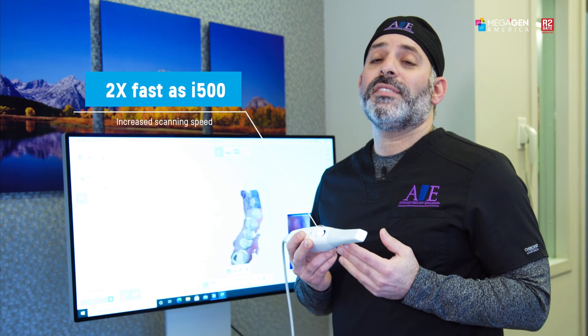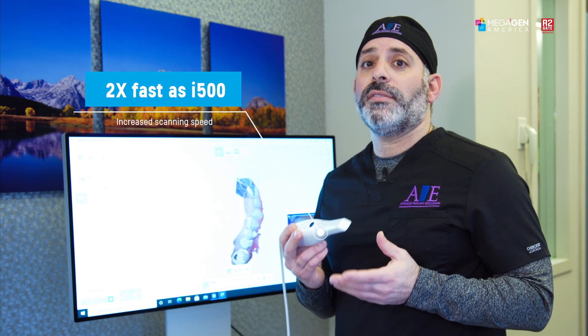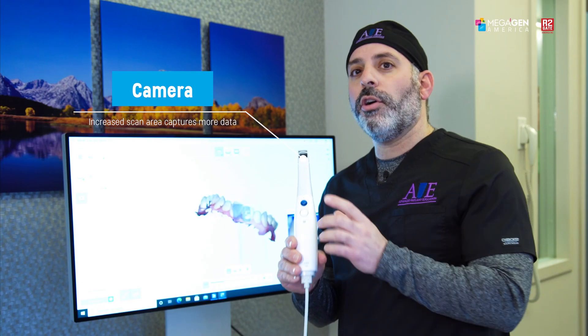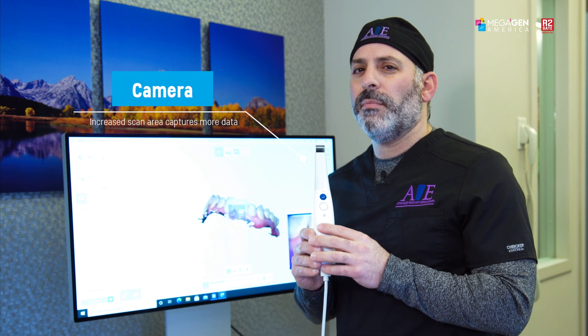Another nice feature is it's now twice as fast as the i500. You'll also notice a new scanning tip — reversible — making the maxillary arch easier to capture. The mirror is angled a little bit more, so those hard-to-reach interproximal areas are now much easier to capture.